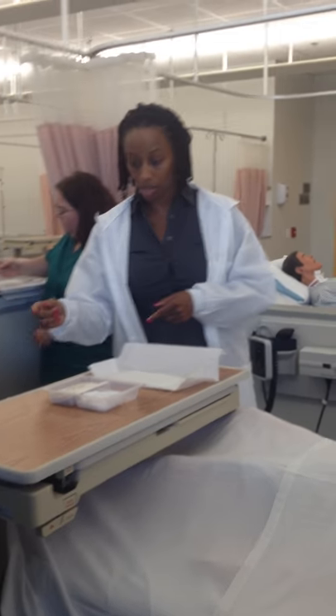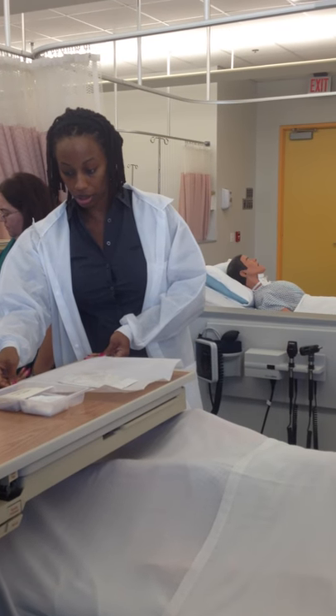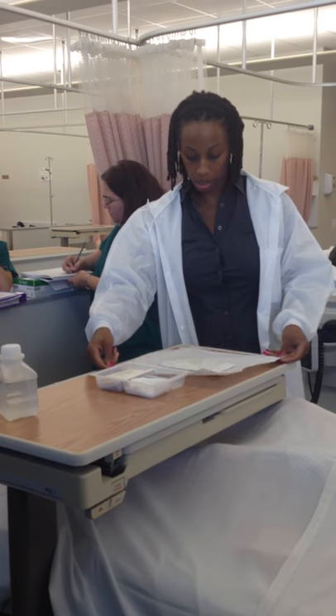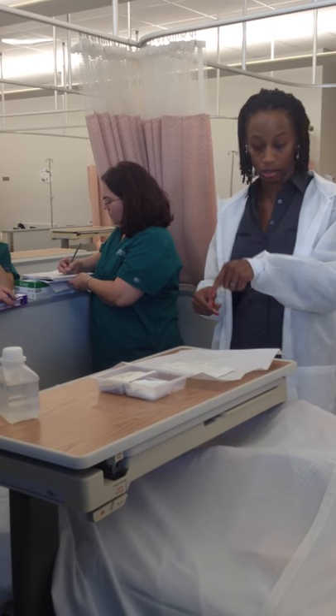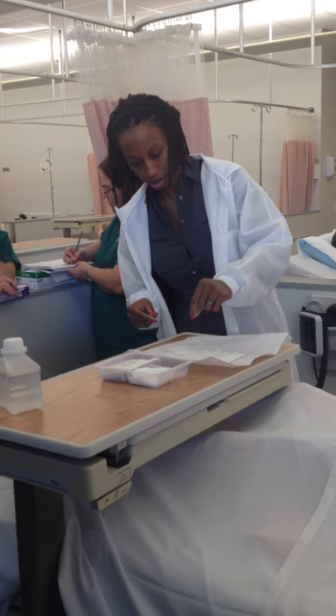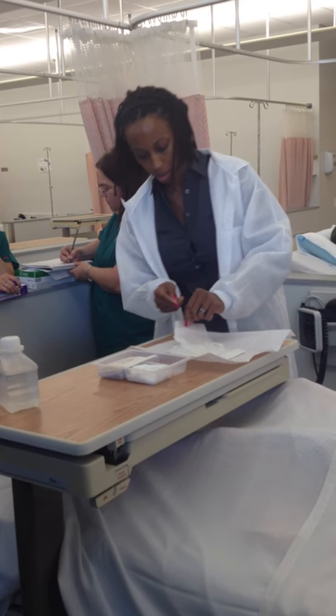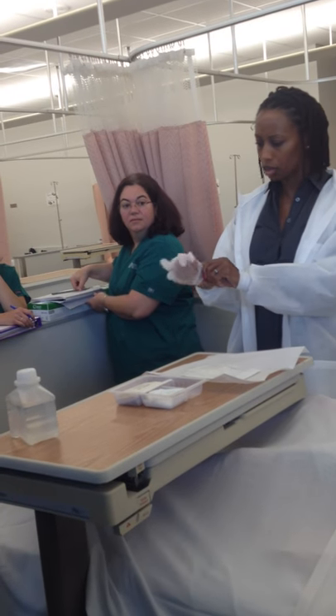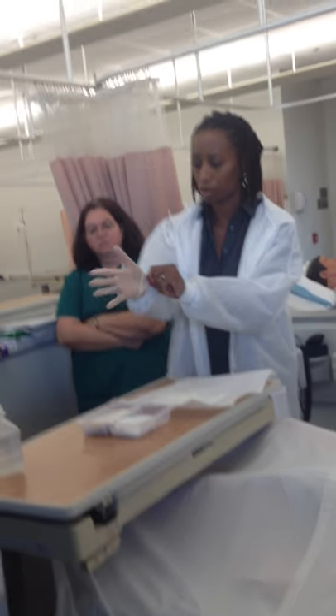You have two sets of sterile gloves: one for your suction kit, one for the care and cleaning. I just open everything up and I'm going to use the gloves that are here first. I grab the first glove. As you can see, the ones in your kit — yours may actually be in paper; mine isn't.